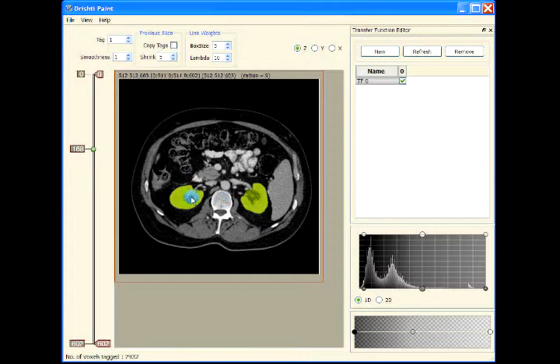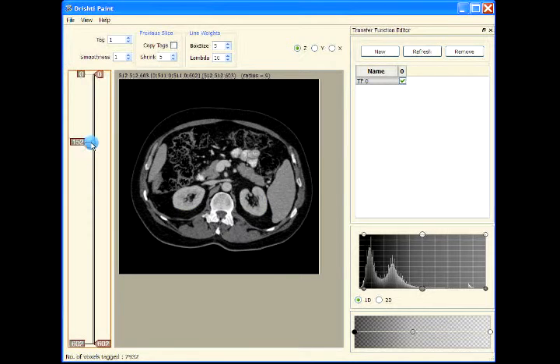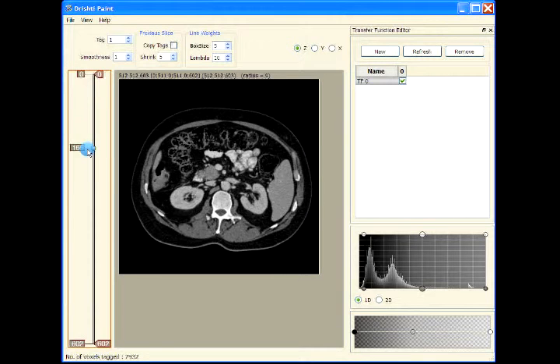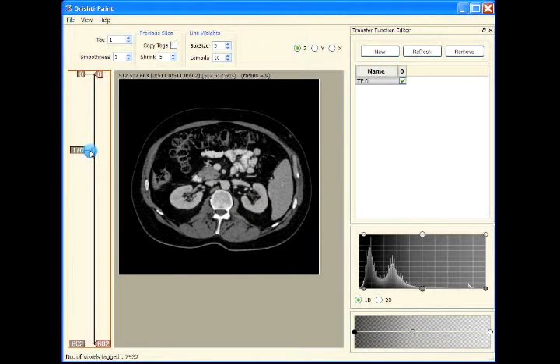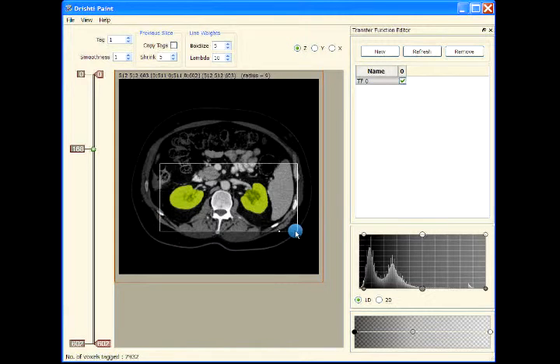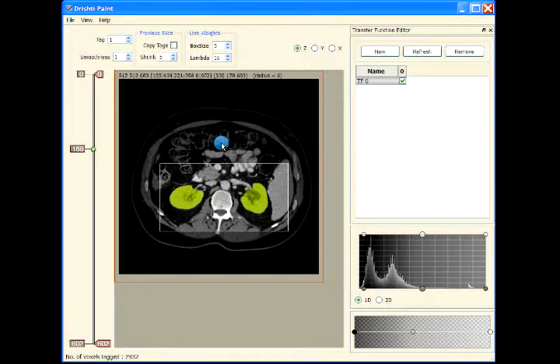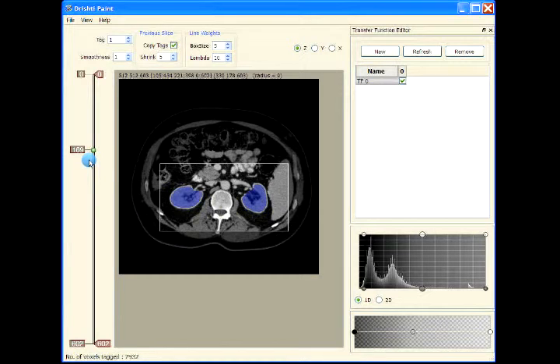We can remove this tagged painted region using the right mouse button. I have now tagged my region, which goes from here to here. We can just select the smaller sub-region so that the algorithm has to work only on a tiny region. Apply copy tags.